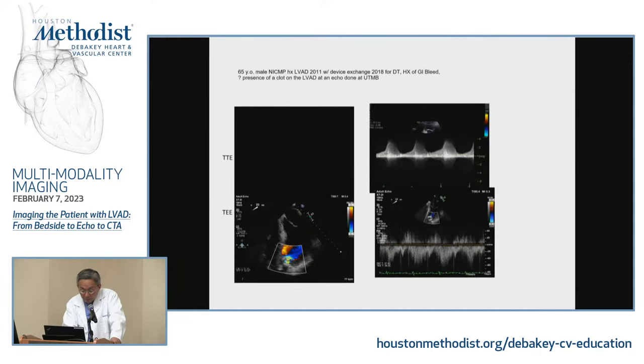And sometimes because of the angle of the inflow cannula, you might not get a very high velocity.